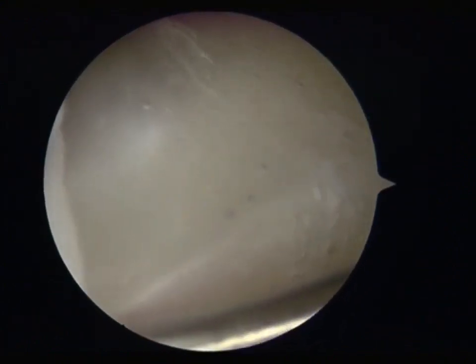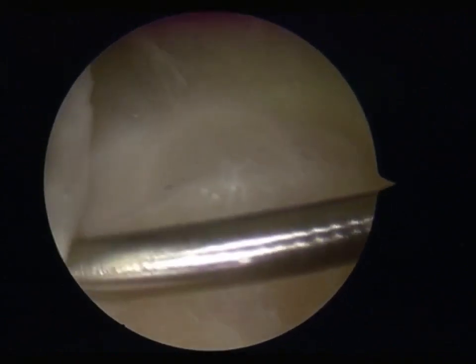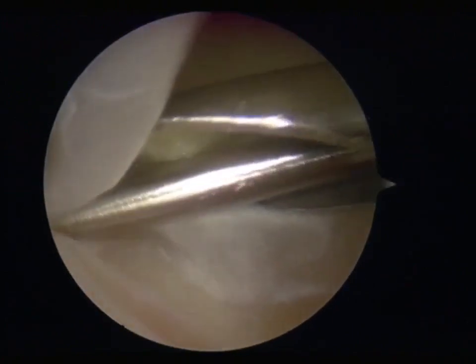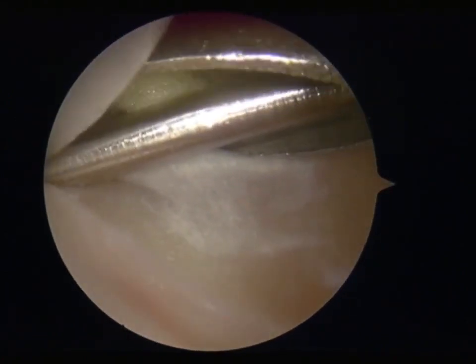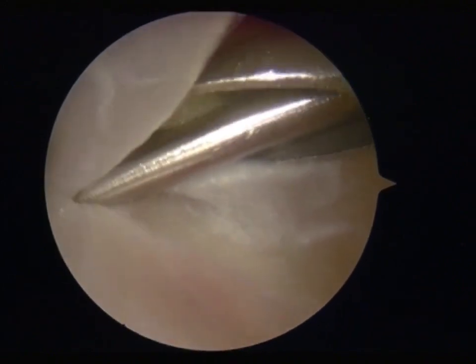Next, after selecting the drilling site, a locator independently developed by Peking University Third Hospital was implanted. A 20 mm deep nail part was drilled using a 1.5 mm diameter drill bit.